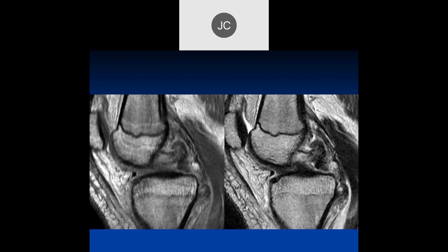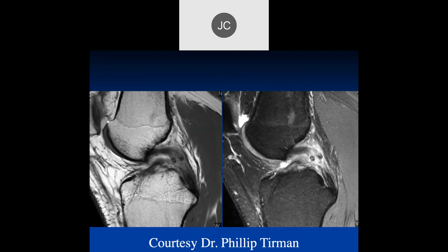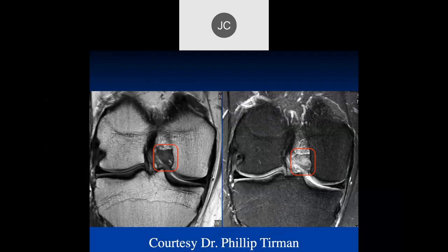That PCL looks completely torn and the femur is subluxed anteriorly. This looks like a complete tear of the mid-substance of the PCL with anterior subluxation of the femur.